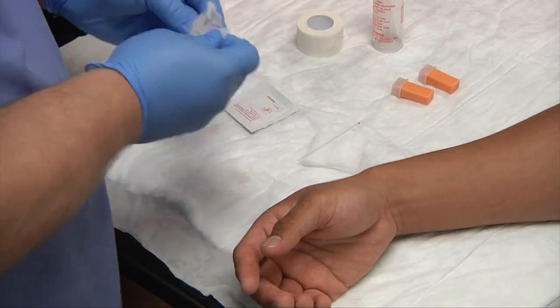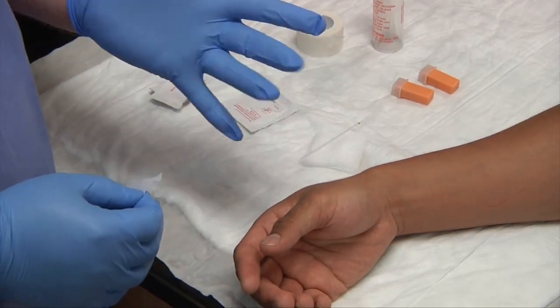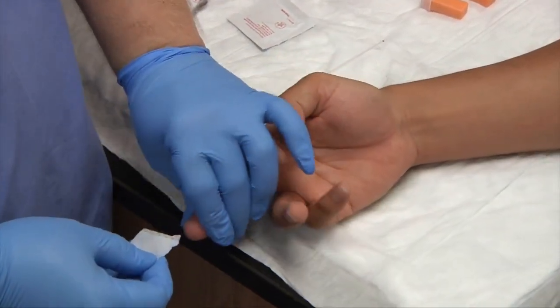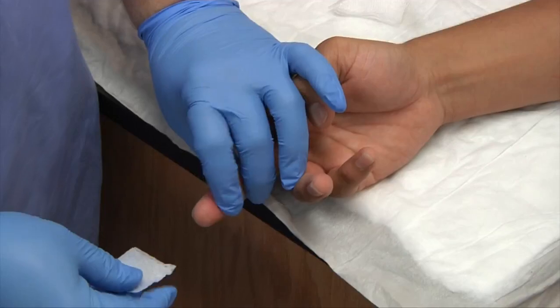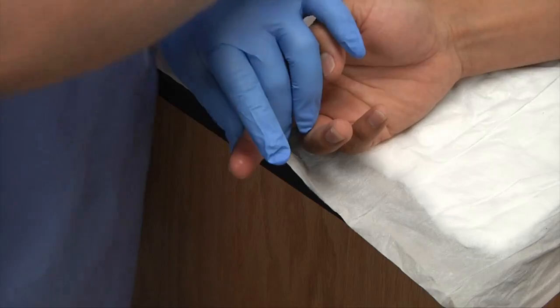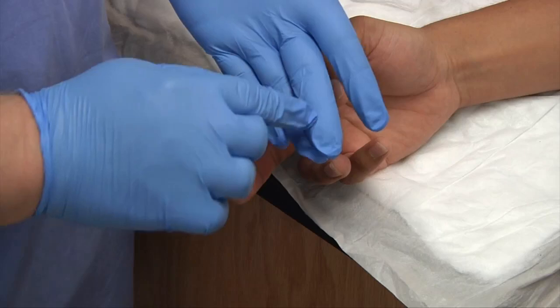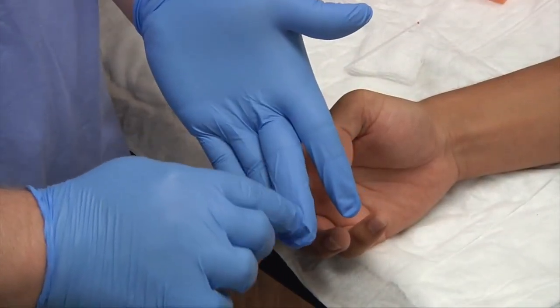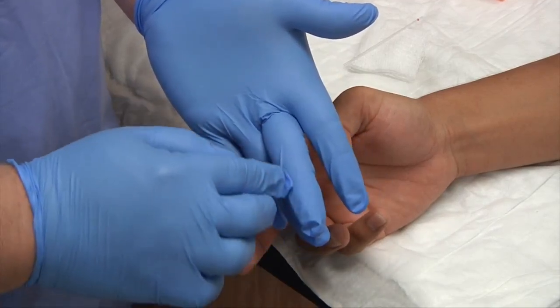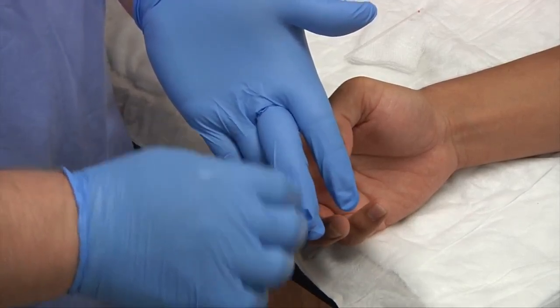Gather one of your alcohol pads. You'll want to puncture the patient's finger — one of their two middle non-dominant fingers. We'll go with this middle finger and point it down, using gravity as our friend. We're going to cleanse the fingertip. While the alcohol is drying, be aware that we do not want to stick center or medial on the patient's finger — we want to go lateral on either side. We never stick medial because there's a chance we could puncture or break some of the bones in the finger.